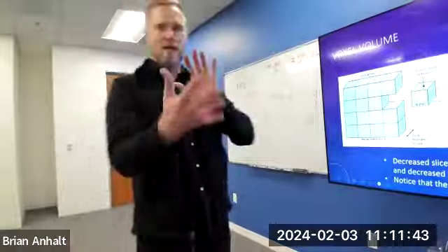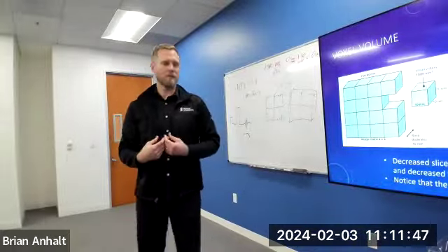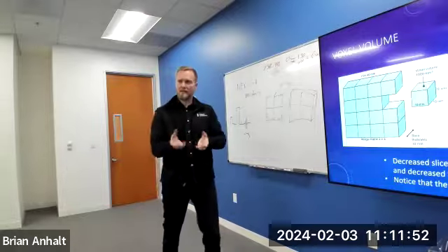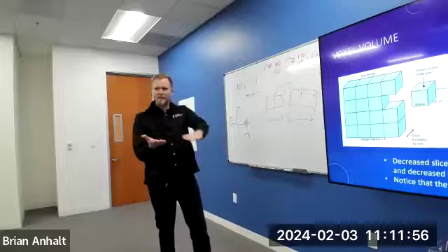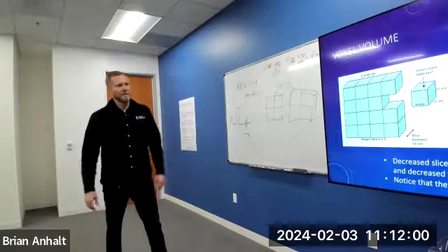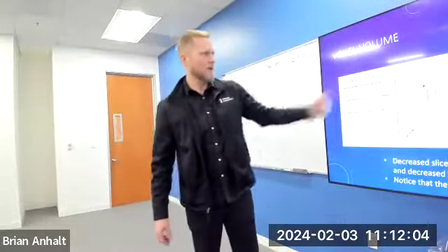It all gets projected onto a 2D image, but it's being collected in 3 dimensions, right? Because we have to have a certain volume of something in 3D space to collect. We have to have a certain volume of protons. We can't excite an infinitely thin layer of protons. There has to be something there. So take a look at this. Decreasing the slice thickness results in smaller voxels, right?